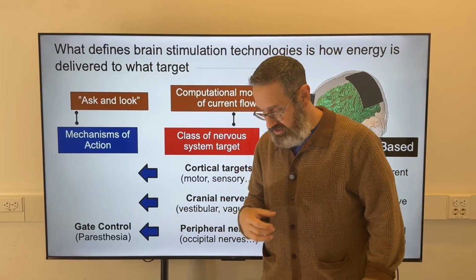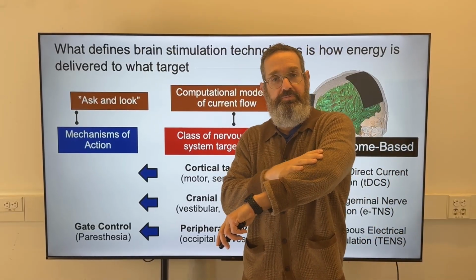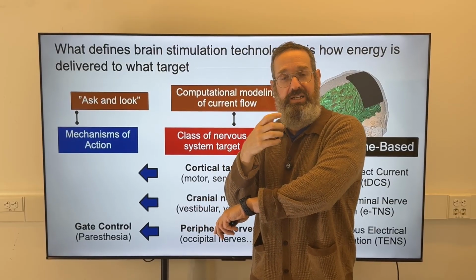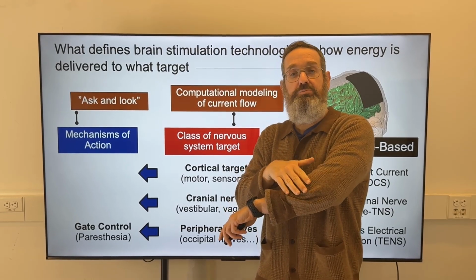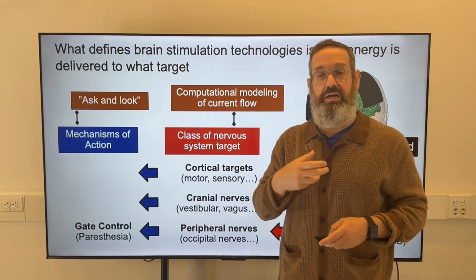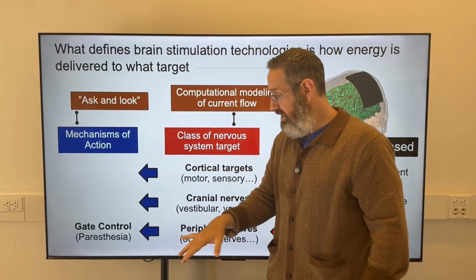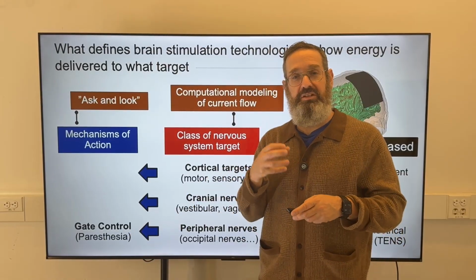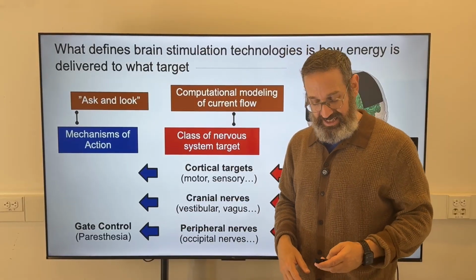And so the notion with how TENS works is, instead of rubbing the arm, we put the TENS unit over the arm, we turn on the TENS unit, and the electricity that's pulsating into the body starts to produce a tingling sensation because it's activating the peripheral nervous system. So the electricity pulsing in produces a tingling sensation. The technical word for that is paresthesia. So that's the equivalent of the device. If you rub it, it will feel better. All right, so that's the mechanism.